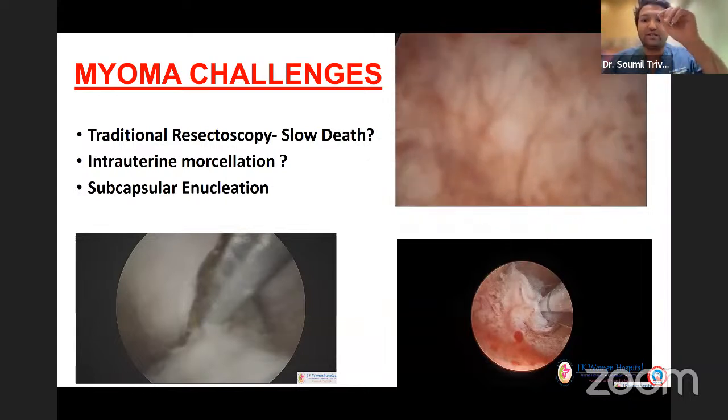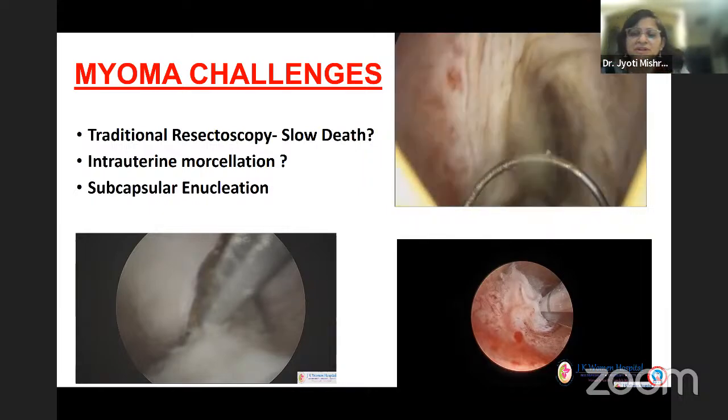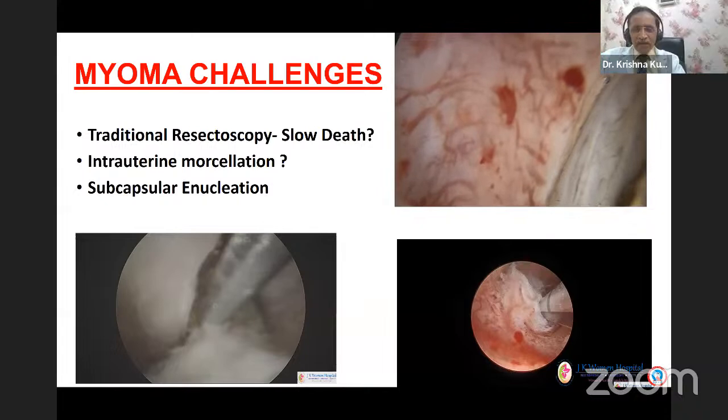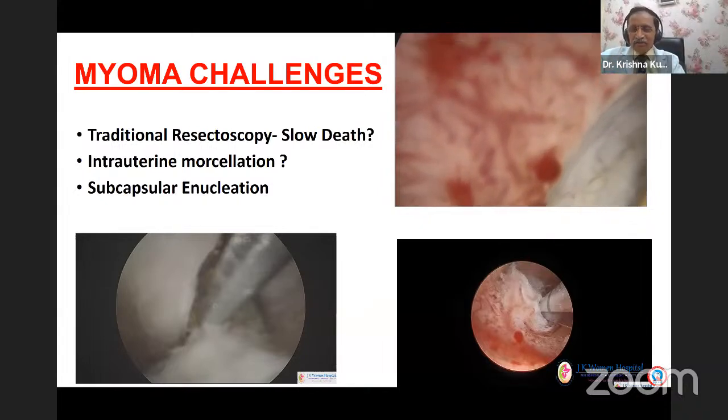But a septum you cannot leave halfway. A septum you've done partially, you can't leave it. Patient will come back with another septum. I'm not talking about a septum, madam. Septum, no one leaves. Fluid overload, fibroid is usually what I'm talking of, not a septum or anything.